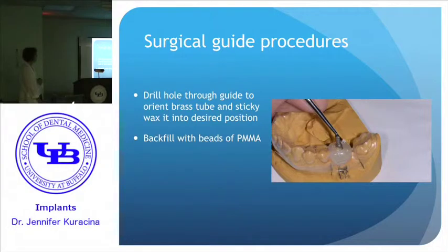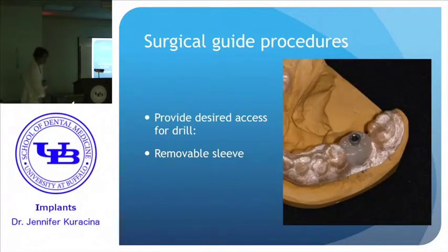And they'll drill a hole through there. They might place the rod in the stone itself or just sticky wax it in position and then backfill some PMMA to keep it in position.